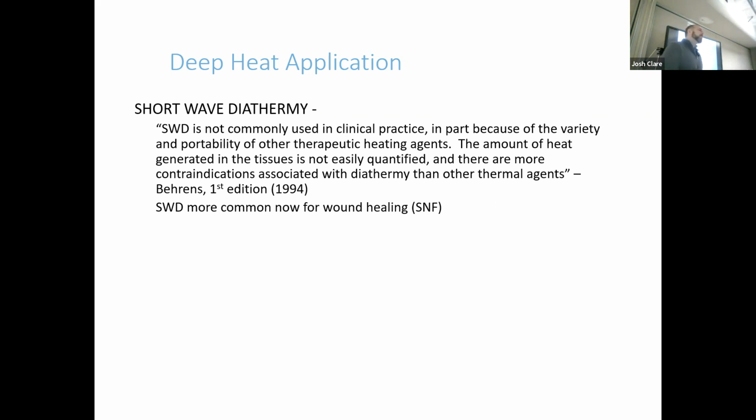And then I said, let me just make sure. I called up a handful of friends. Actually, I called up any PT that I knew and just said, I use diathermy, do you use diathermy? And resoundingly, they said, no. What, are you kidding me? Is that what you called? First time I talked to you in 5 years, that's the question you asked? Oh yeah, how are you? How are the kids? Sorry, how do you use diathermy?